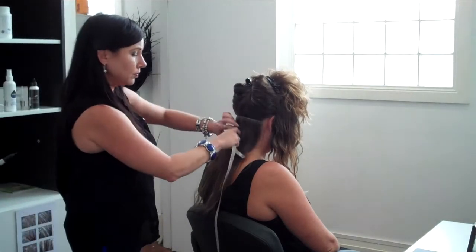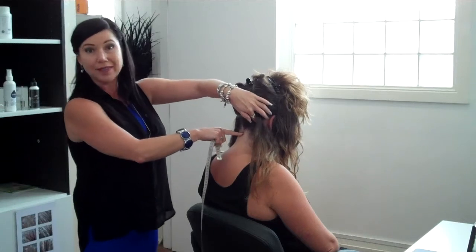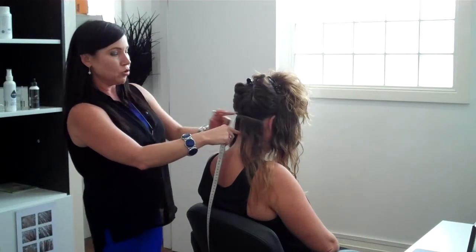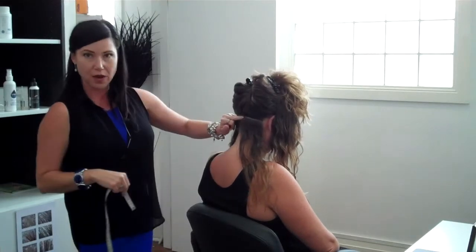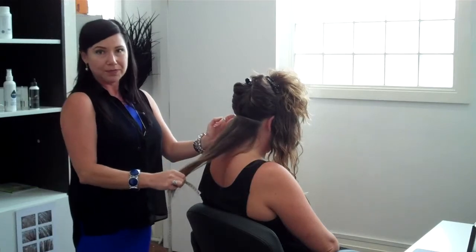You need to make sure that you measure and mark accurately so you can get back into the same location after the treatments, which is generally four months later. For the hair cycle area, we measure up from the nape, which is the hairline, because generally that will not move unless you have surgery. So we do two increments — this one here is five centimetres up — and then we go in from the side hairline.